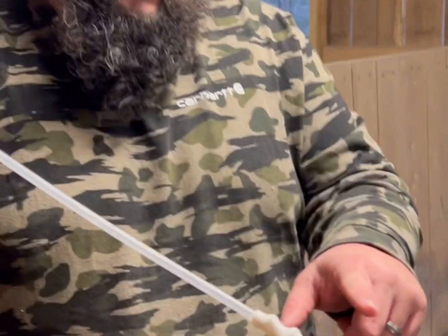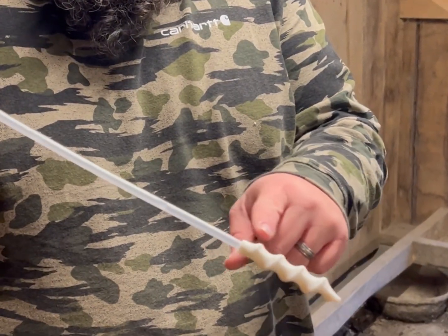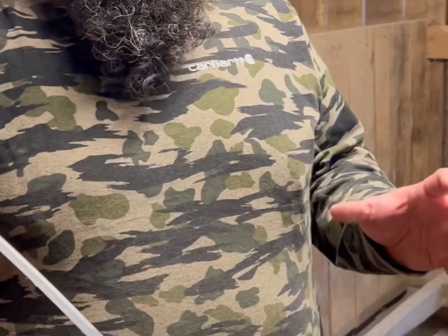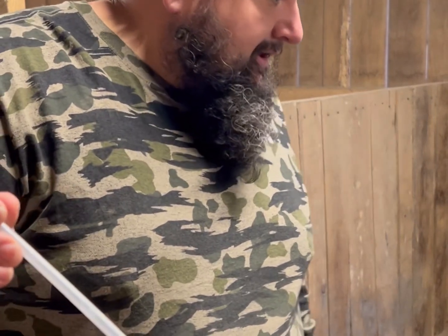This is a spiral tip catheter — a breeding rod for a pig. The cervix is shaped like a spiral, just like that, and it actually twists in. Uterine contractions draw in the semen. This bottle is fresh, non-frozen — it's good for 14 days as long as you keep it at 64 degrees and turn it every 12 hours. It's an extender.